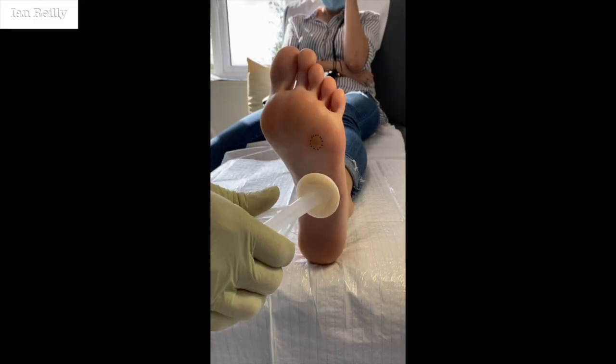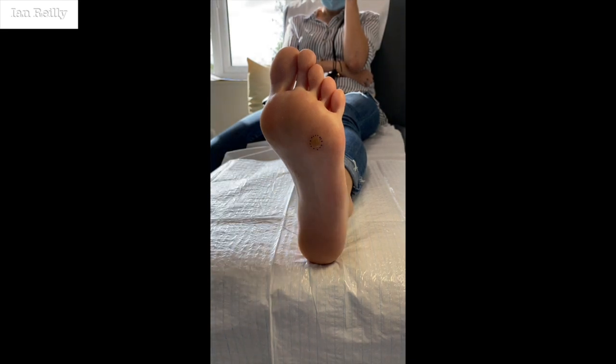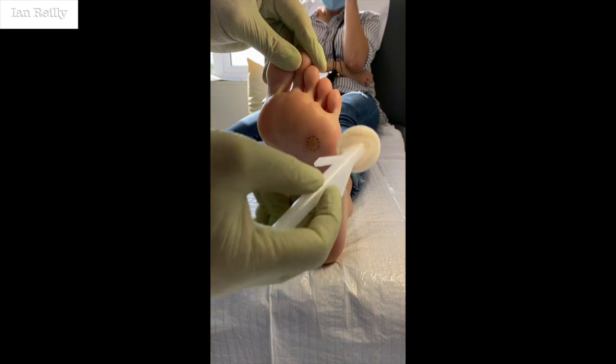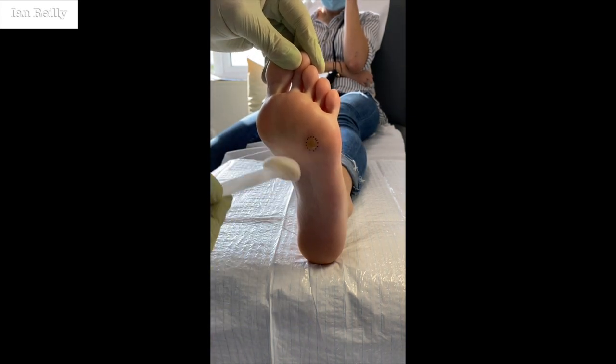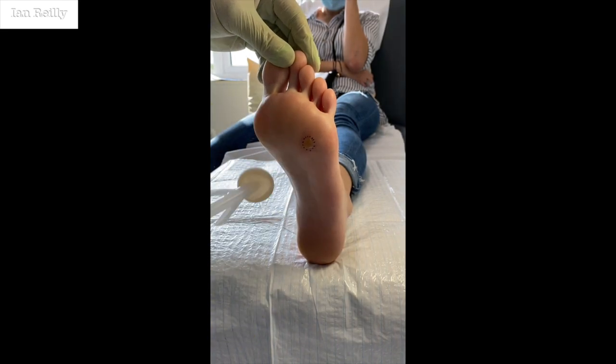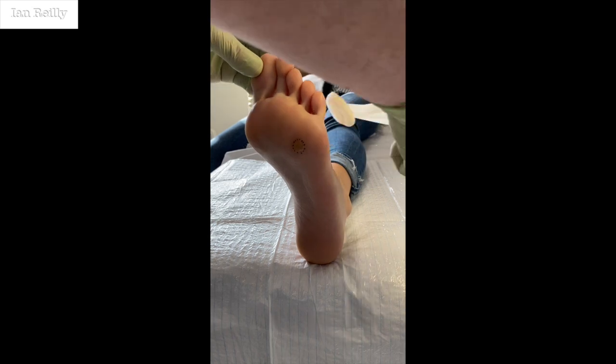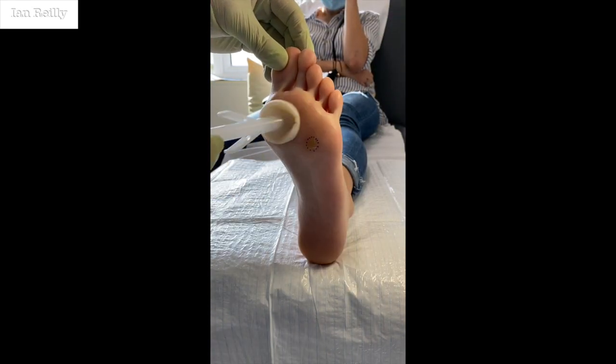We'll start off with a bit of skin prep — a little chloroprep, just cleaning the skin. We'll send this off to histo as we like to do, and I'll add the results in a bit, but we're pretty sure it's going to come back as verruca.